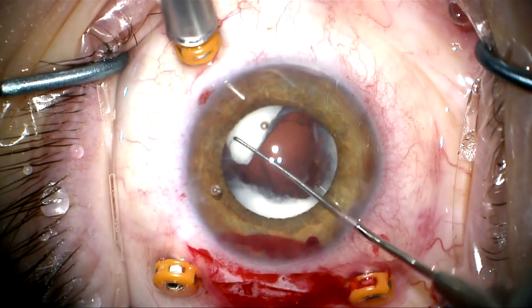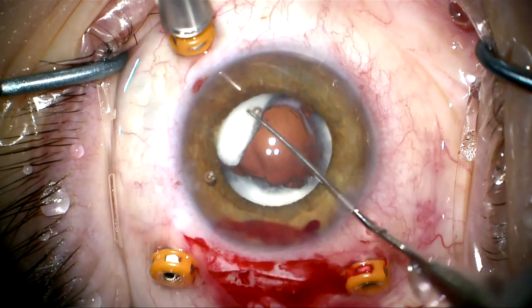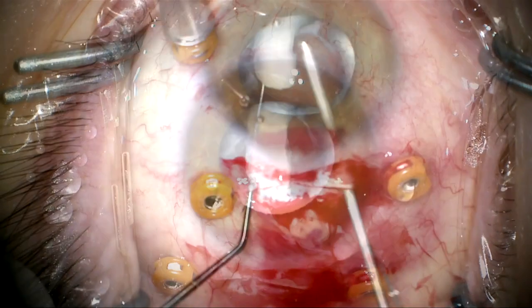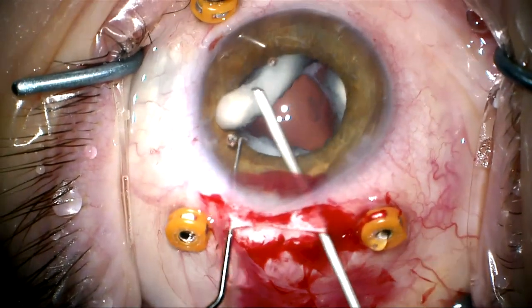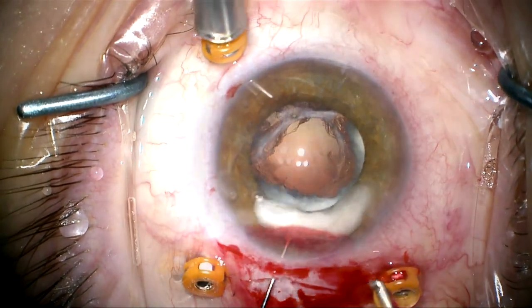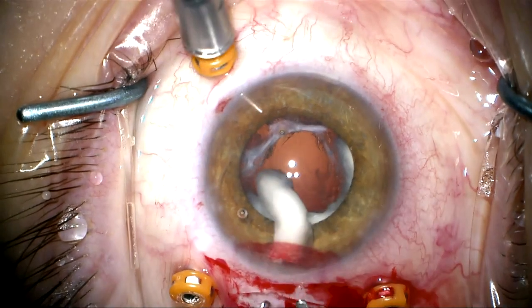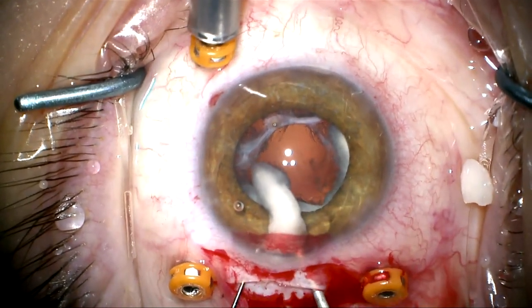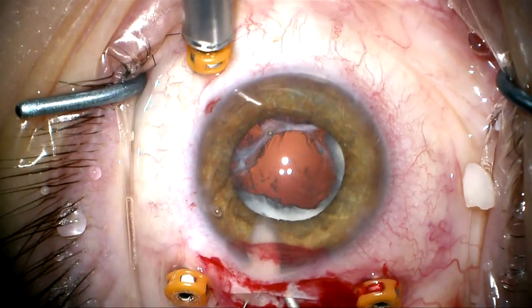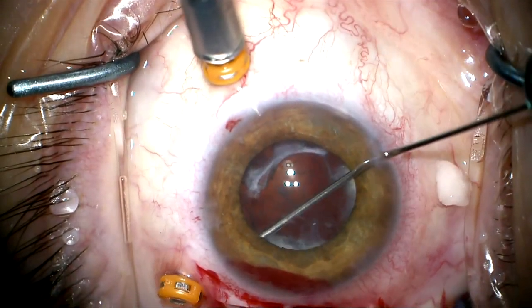I'm going to use a Sinski hook and pull this large Soemmering's ring out of the recess it's been sitting in for a couple of decades. I want to make sure it doesn't fall back, so I'm going to use a bimanual technique to manipulate this toward my incision and then use infusion to push it out. Here we can see the segment of Soemmering's ring coming out. Now we're going to do the same thing on the other side.